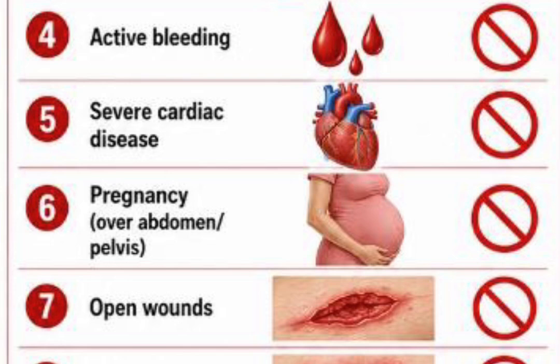Don't use it for a patient that is pregnant, especially over the abdomen, because it could induce uterine contraction causing preterm labor. So you don't use it for patients that are pregnant over the abdominal area, because you don't want to bring out a baby that is not yet ripe to come outside. Don't use it for patients over an open wound. Why? Because it will cause an uneven distribution of the current around that area, and it's not nice.